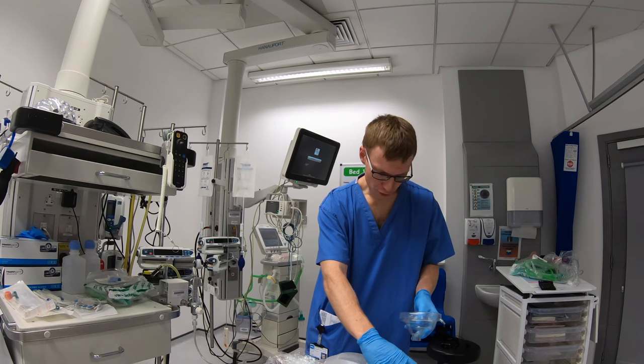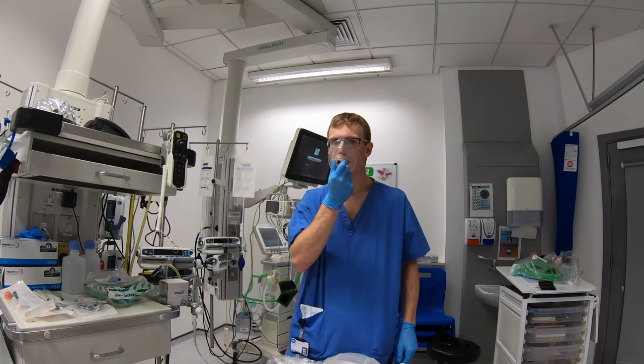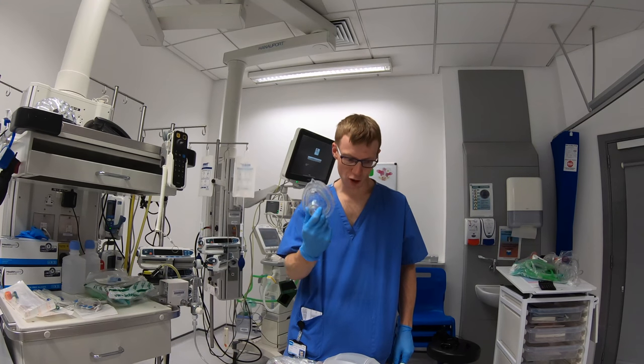So the first thing I'm going to do is just take the face mask — and it's very hard to breathe through. I've noticed this is quite hard to breathe from the top.